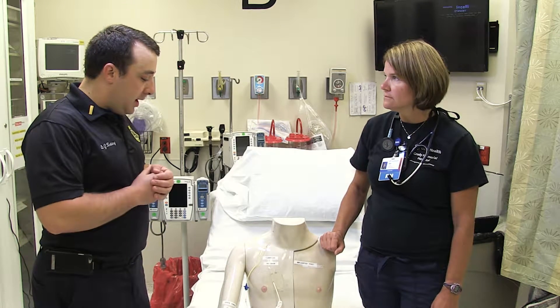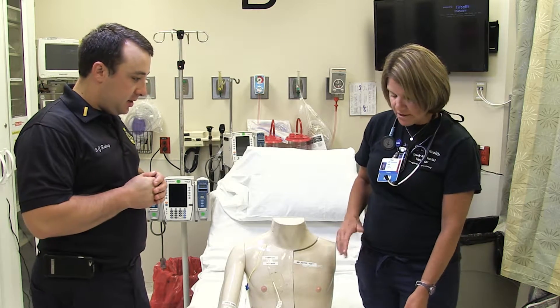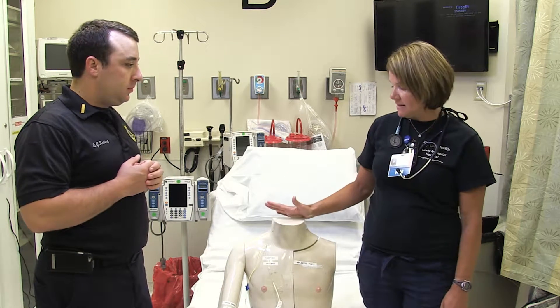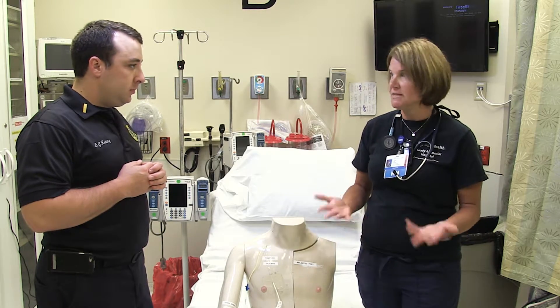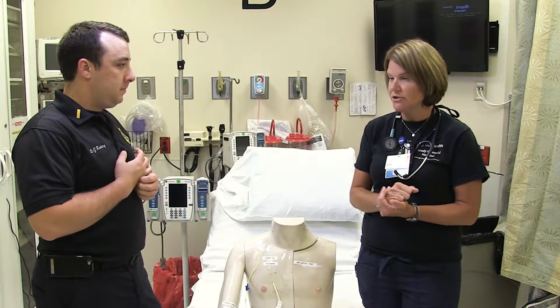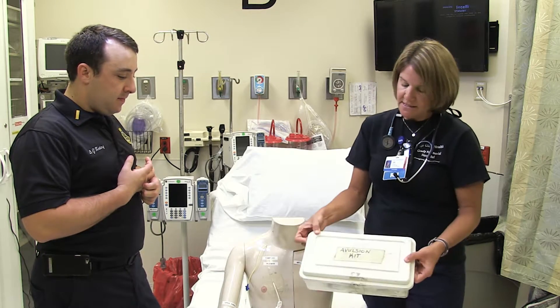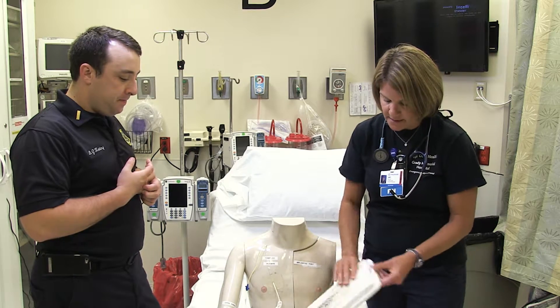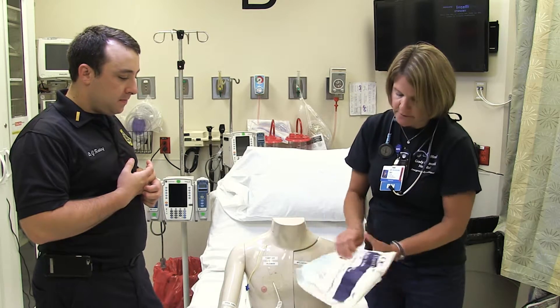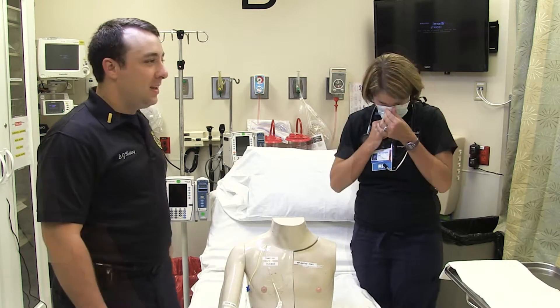Let's talk about what our procedure is going to be to access these different devices. Our setup in the hospital is obviously going to be different than your setup in the field. The most important thing is keeping things sterile — not clean technique, but sterile technique. Do your best to wash your hands or at least use an antibacterial hand cleanser before doing it. The kits are going to come something like this for you to use. The first thing you're going to do is open up a sterile field using a trauma dressing, and first thing — put a mask on.